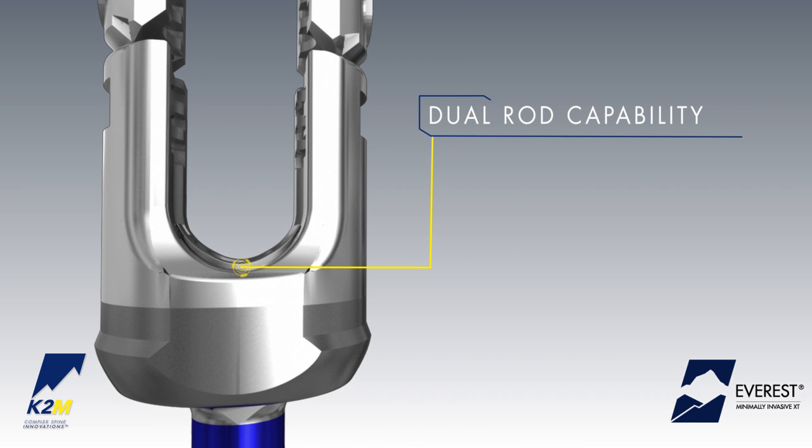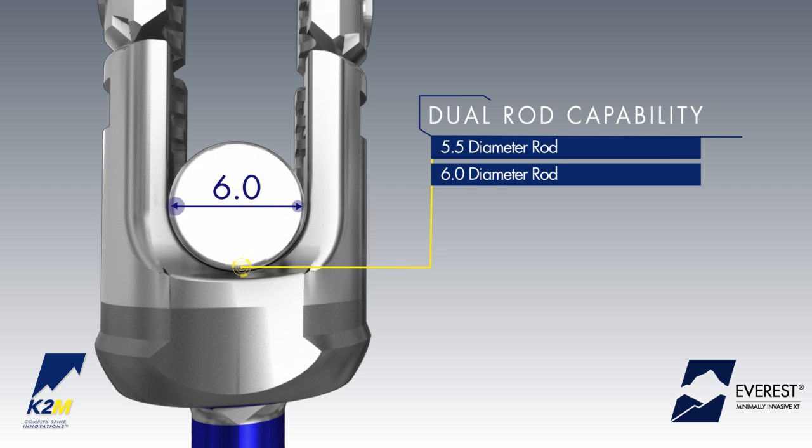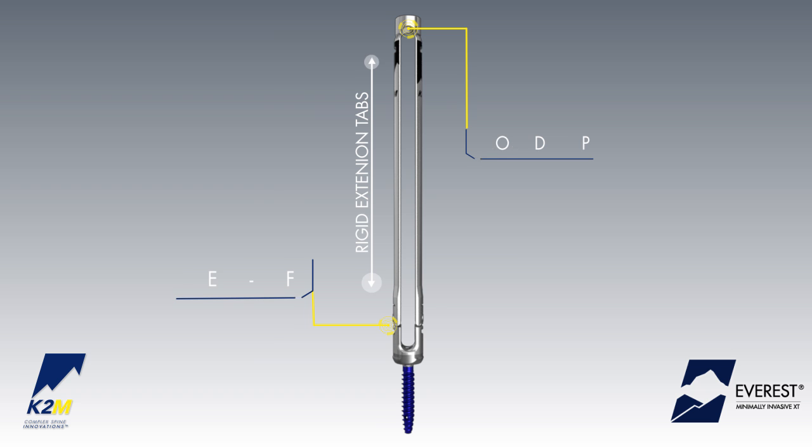Dual-diameter rod capability allows for the use of 5.5 and 6.0 diameter rods. The XT screw is designed with rigid, closed-top break-off extension tabs to assist with minimally invasive rod passage.